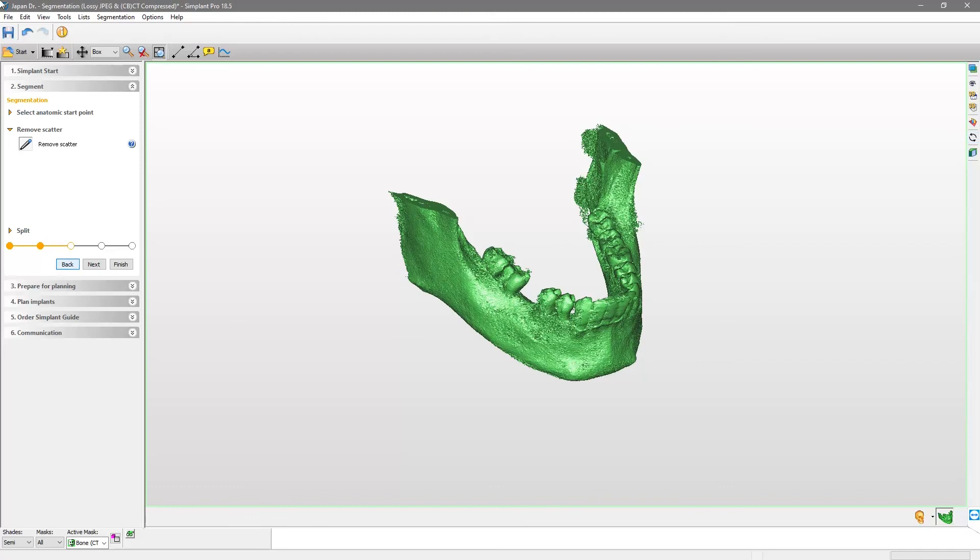If you made any mistake, press the Undo button or Ctrl-Z on your keyboard and try again. Once the 3D model is satisfactory, you can ignore the two advanced next steps and click Finish to end the case preparation.